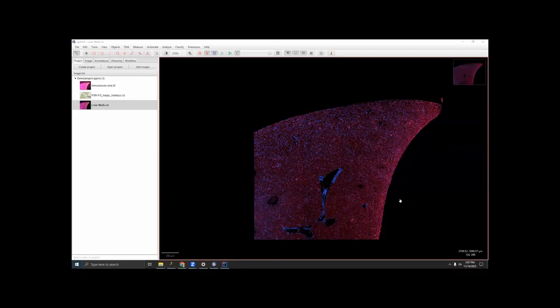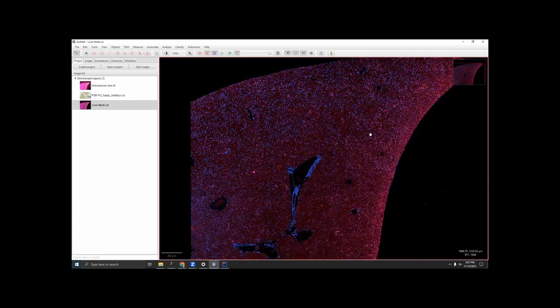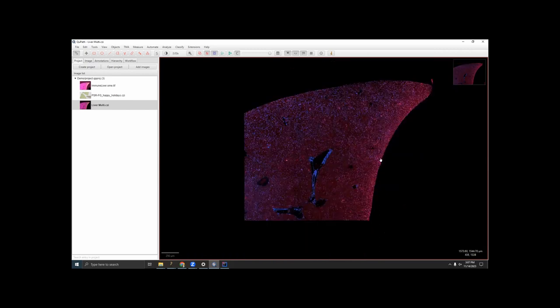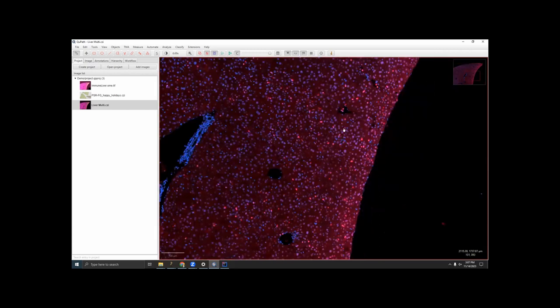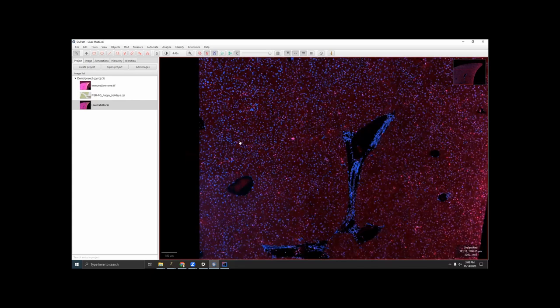So what we have here is a piece of liver, and this was stained with a few immune markers. In blue is DAPI, and in red is Ly6G. And what you can see very clearly is that there's this edge artifact where all of the cells over here are brighter than all of the cells in the background over here.